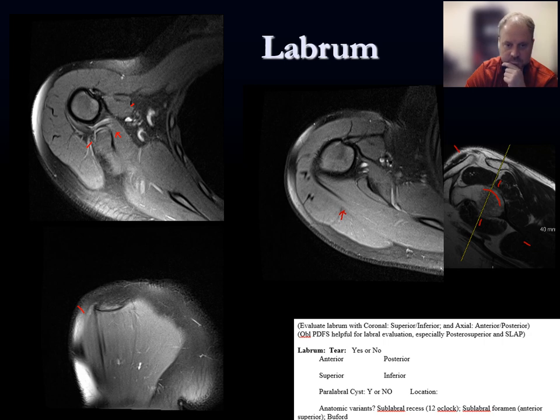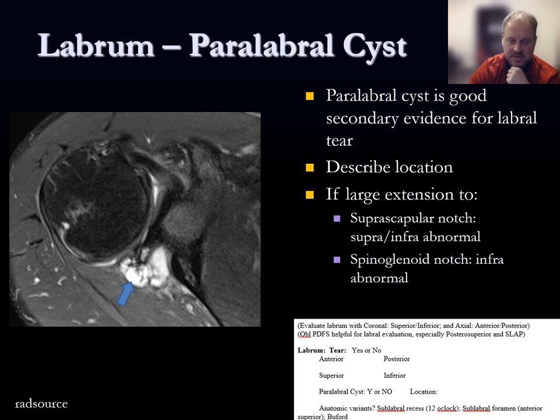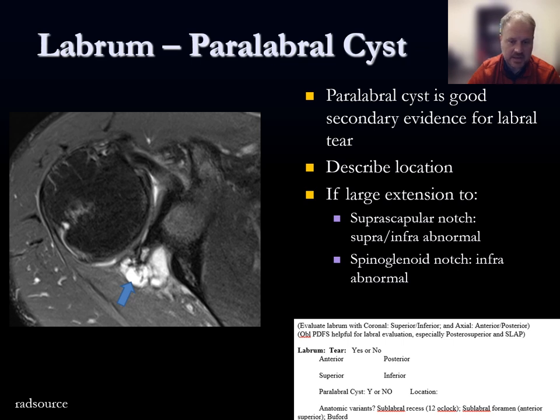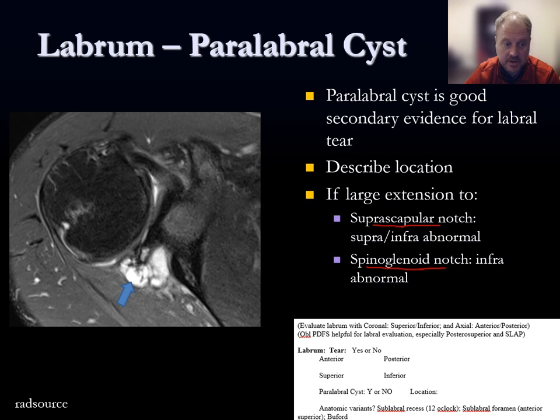Paralabral cysts are very helpful secondary evidence for a labral tear. Describe their size and location, and note if they are large enough to impinge on the suprascapular notch or sphenoglenoid notch. Both are along the course of the suprascapular nerve, which innervates supraspinatus and infraspinatus. Impingement at the suprascapular notch may cause denervation changes to both supraspinatus and infraspinatus; impingement at the sphenoglenoid notch may cause denervation changes to only the infraspinatus.